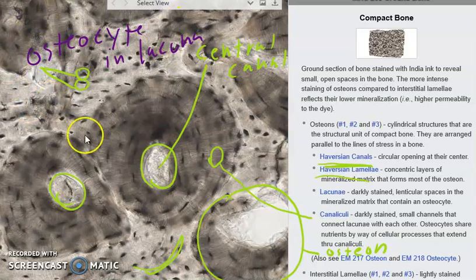And when you guys do your labeling, figure out a color that actually works. This is actually my third time making this video. It's crashed three times. And I can't figure out a color that actually looks nice here.